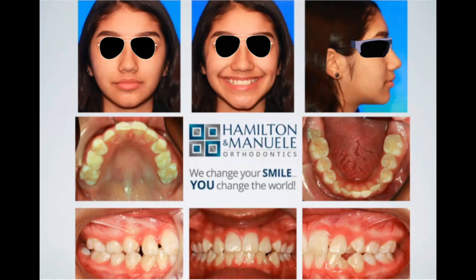And why? Again, I haven't shown you a Ceph yet. Flat. And why do you say that? Yeah, so it's a little bit more gummy in the back than the front, which would indicate a little bit more flat of an occlusal plane angle, right? What's our ideal? Who is studying for boards? What's the ideal occlusal plane angle typically? Yeah, 6-7 degrees, somewhere in there.